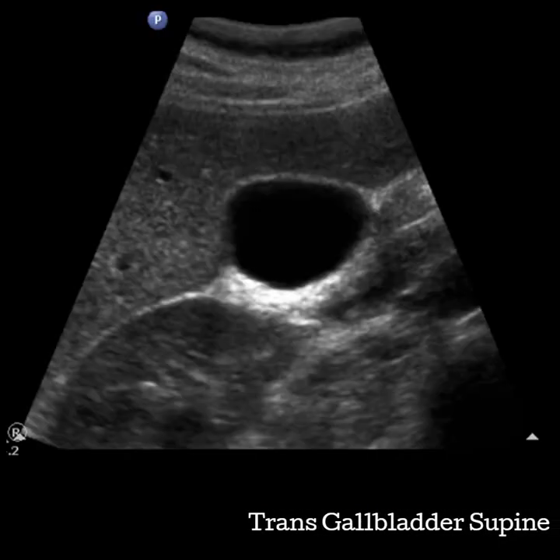Turn your transducer 90 degrees and you should see the transverse view of the gallbladder. Make sure that you move towards the feet to see the fundus and towards the patient's head to get to the neck. These are common places for pathology to hide out. Find the widest portion of the gallbladder where it is nice and round. This is going to be typically at the body.